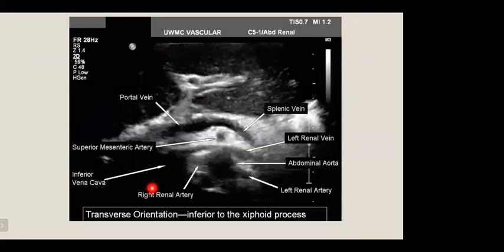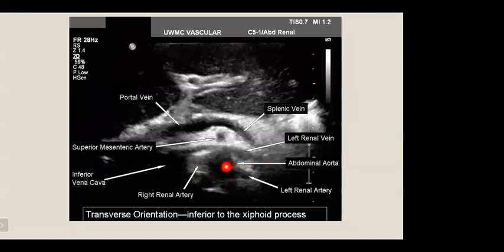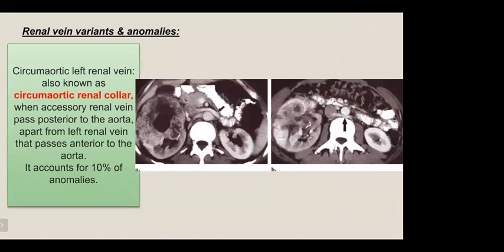This ultrasound image in transverse orientation inferior to the xiphoid process shows the renal arteries and veins. We can identify the abdominal aorta, the right and left renal arteries, the left renal vein entering the IVC, the superior mesenteric artery, the portal vein, and the splenic artery.